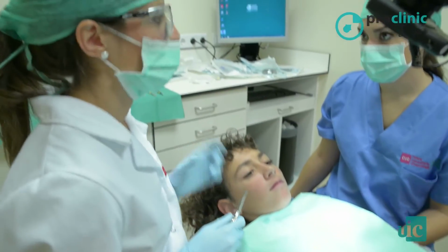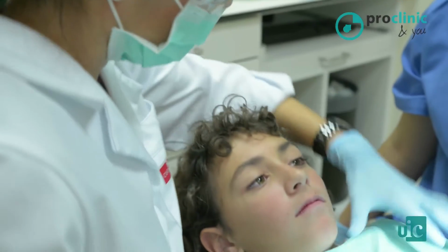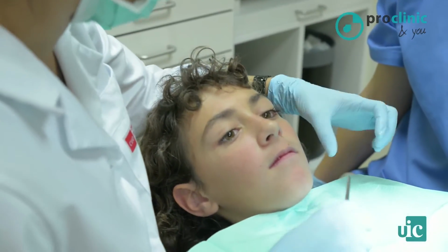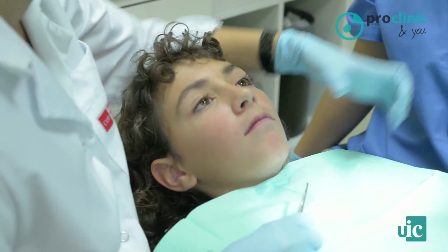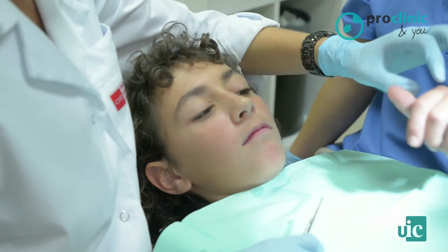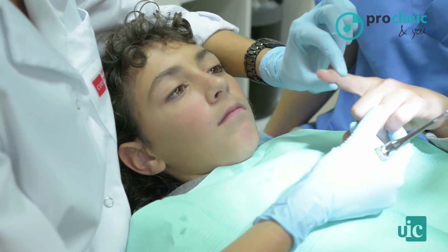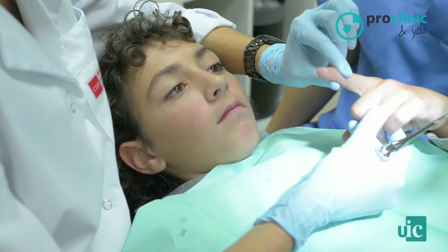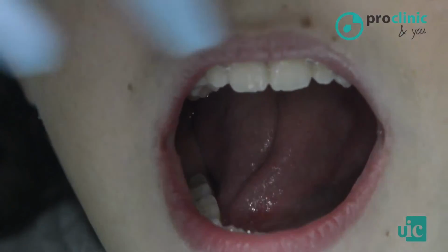Next, we are going to luxate the tooth to detach the periodontal fibers. You will feel some strength, but not pain, only strength and pressure. Give me a finger and I will show you an example. I'm grabbing your finger and you can feel that I'm moving and squeezing it, but it does not hurt. And I will do the same with the tooth. Do not bother, it is just pressure.